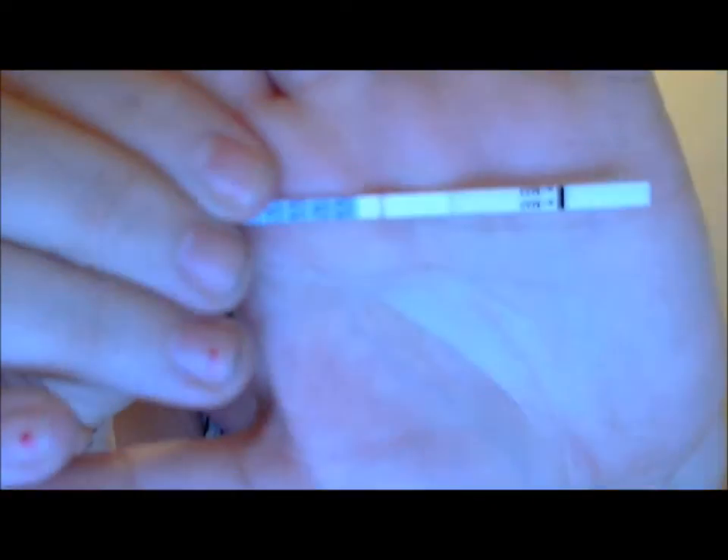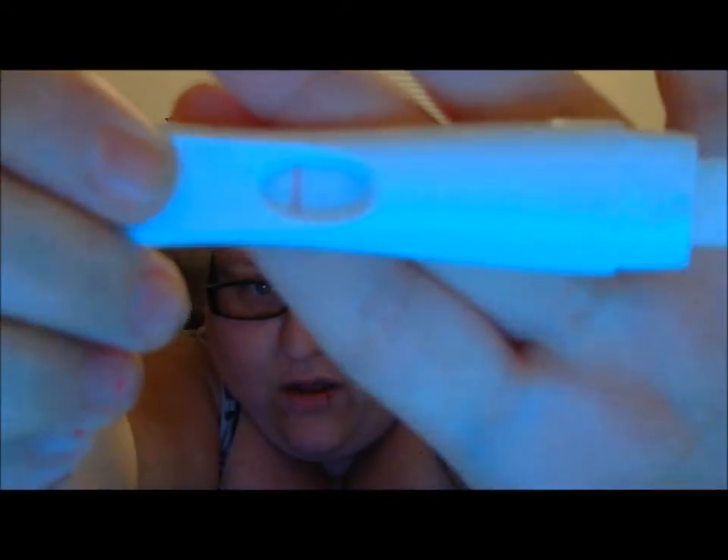Here's today's ovulation test — there's barely a line there, you guys can barely even see it. This is the third Answer brand one I've used, and this is the first time I've ever gotten a line at all. Because I got the intermediate ferning on the microscope, I'm hoping maybe that means in the next two or three days I should ovulate. Today's cycle day 23, so hopefully I will ovulate in the next couple of days.